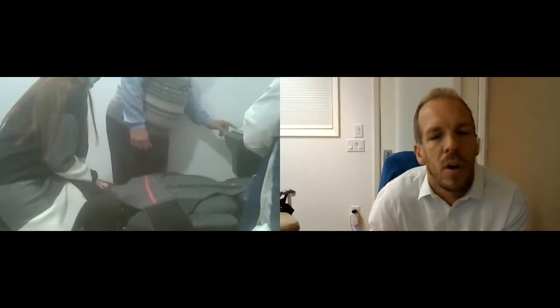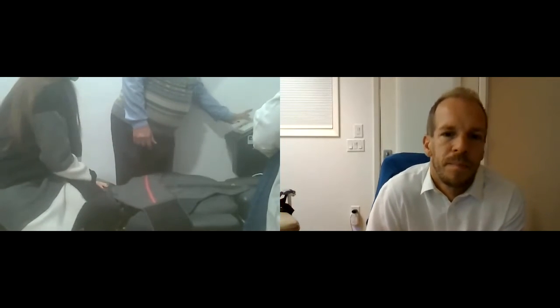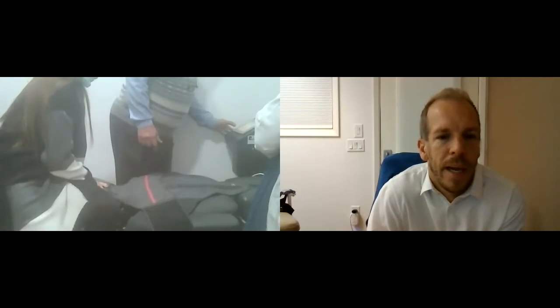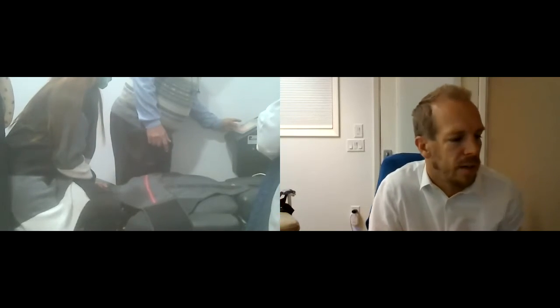And then just make sure it's on kilograms in there and not pounds. Oh, sorry, go to maintenance, in the upper right-hand corner in red. And then just make sure it's on kilograms and not pounds or newtons. It's on kilograms, okay, then you're good. Then just go ahead and go back. It'll stay on kilograms as long as nobody changes it. I would just check every once in a while and make sure it's on kilograms.